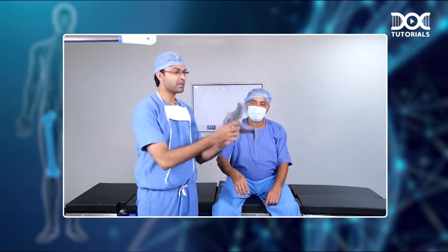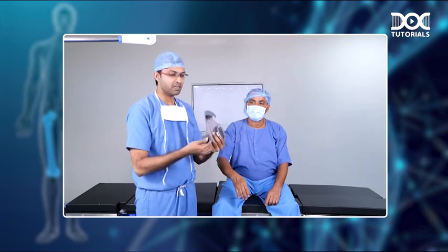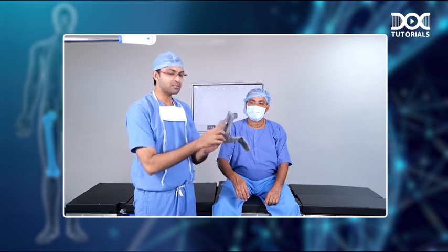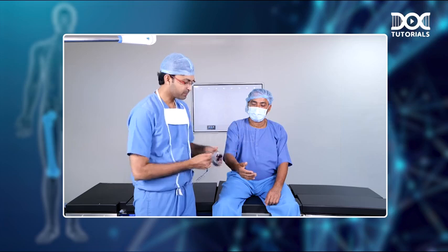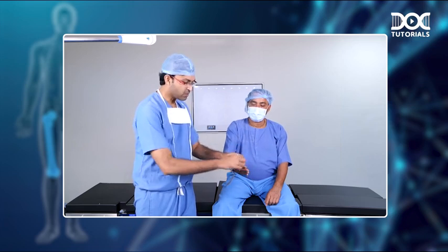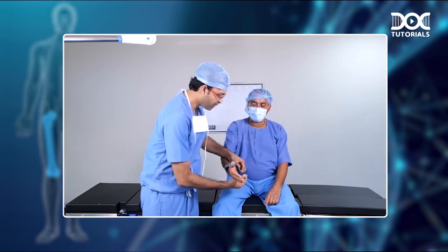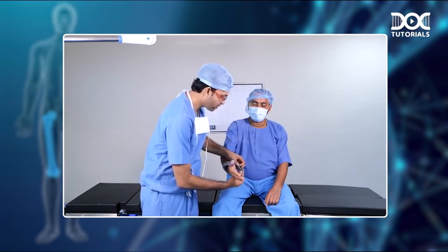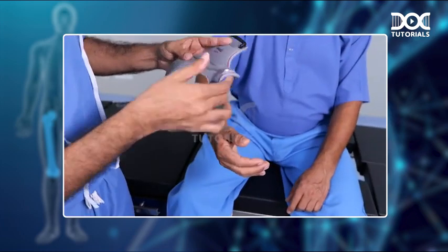So remember, thumb spica has a long part and this fabric material that comes at the bottom. So remember, this longish part should come on the radial aspect of the thumb. So we apply the splint like this, and you secure the thumb first, and then you wrap this part around the wrist and securely fix the velcro strap. So this is how you apply the thumb spica splint.